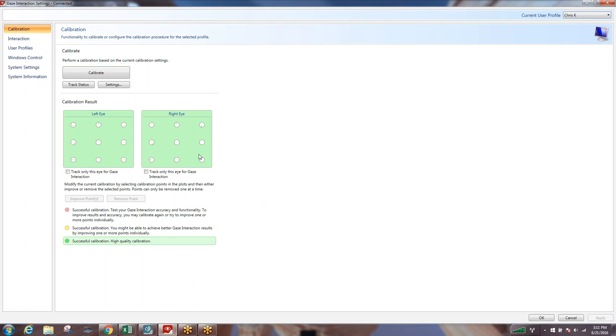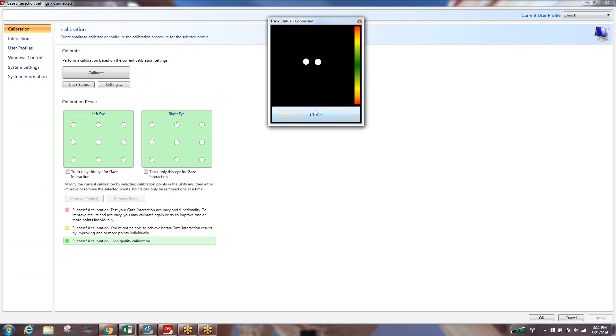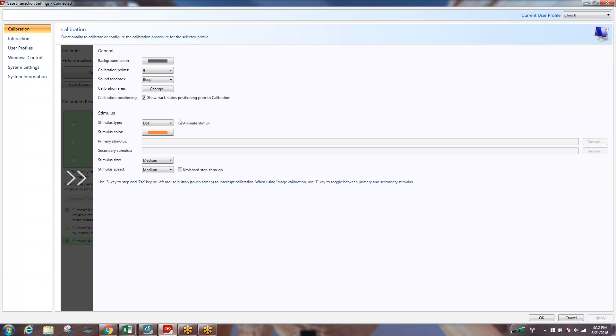If you have issues, you can go into settings and do fewer calibration points. You can also remove the track status box — if you have a child or someone who doesn't hold attention very well, you may want to uncheck this box, so when you first hit calibration it won't pop up that bigger version of the track status box. That lets you get into the calibration and get working while you have that customer's attention. Other settings include the stimulus type — putting a picture or video — the speed, and keyboard step through. Keyboard step through is beneficial when someone isn't great at maintaining attention; you can plug a keyboard into the device and literally step through point by point.